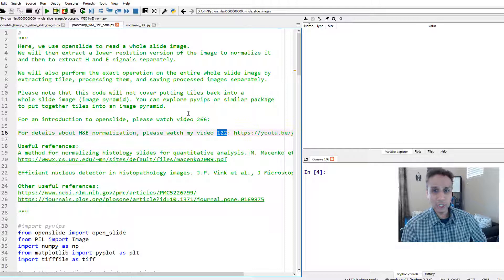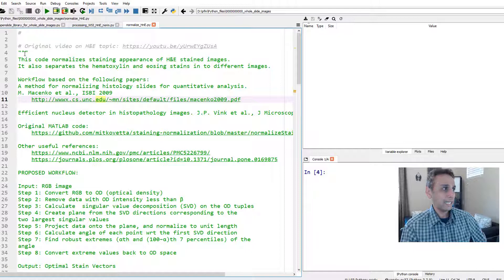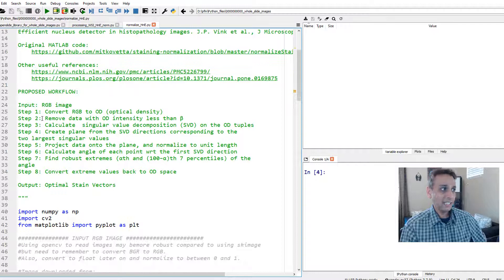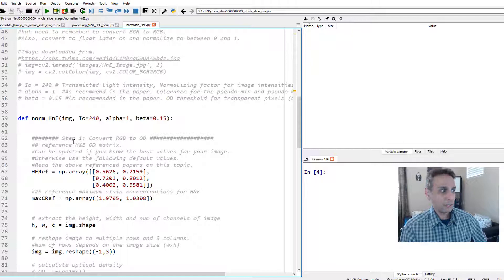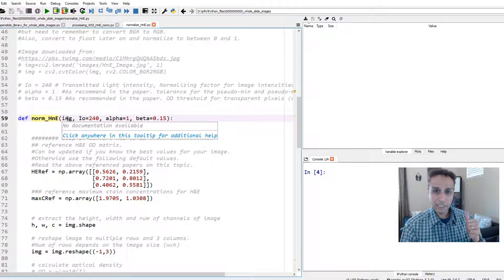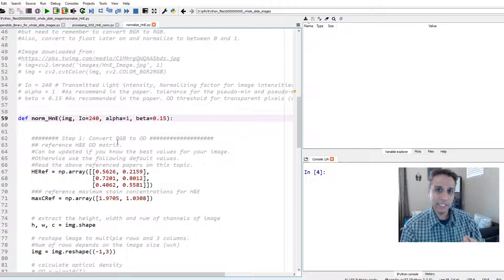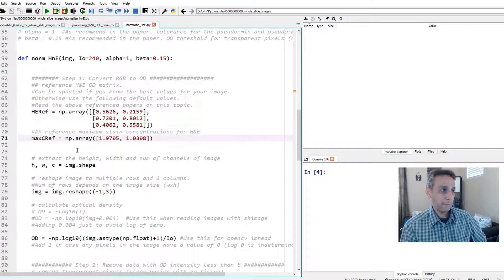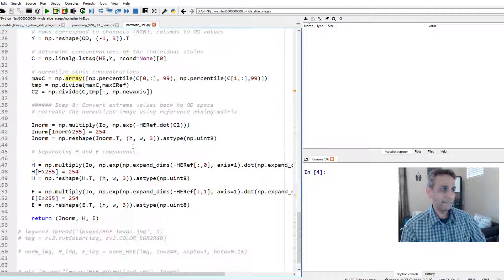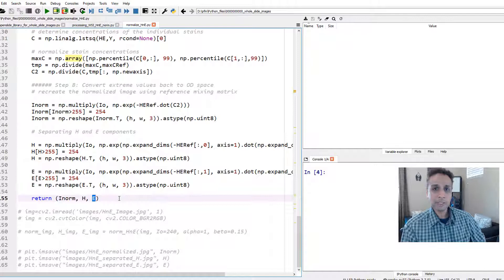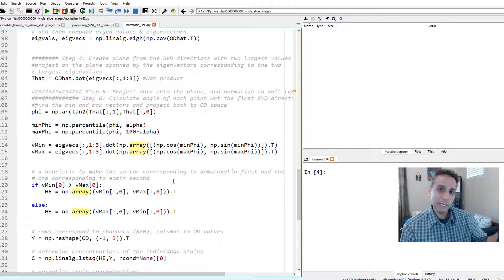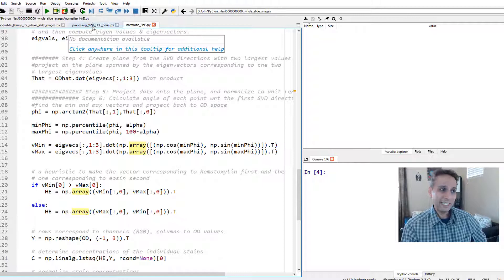When it comes to normalizing H&E, I covered this as part of my video number 122, so please check that out. This is exactly the same code I used there. I created a function called norm_HnE, and it takes the original input image that you'd like to normalize, IO (intensity — I use 240, it works for this image), alpha equals 1, and beta equals 0.15, the same values as in the original paper. What does this give out? Three things: the normalized image, the H image, and the E image.